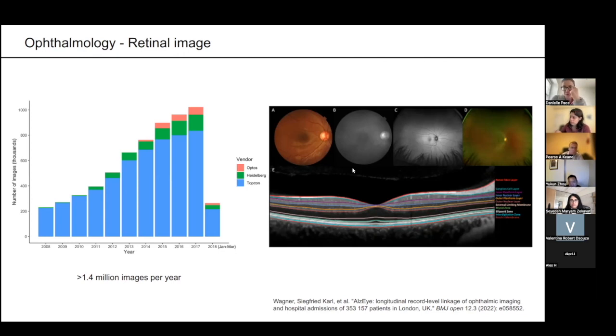And the second characteristic of retinal images is that they have lots of different modalities. For example, color fundus photographs, ultra-widefield imaging, which shows the peripheral areas beyond the macula, and also optical coherence tomography, which shows the different anatomic layers of the retina. All of these different modalities provide complementary information for us to observe and understand the retina. And this builds the foundation for us to think about multimodality research, at least from the vision side, in the near future.